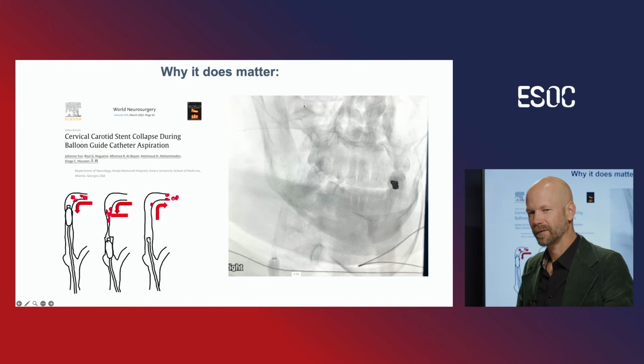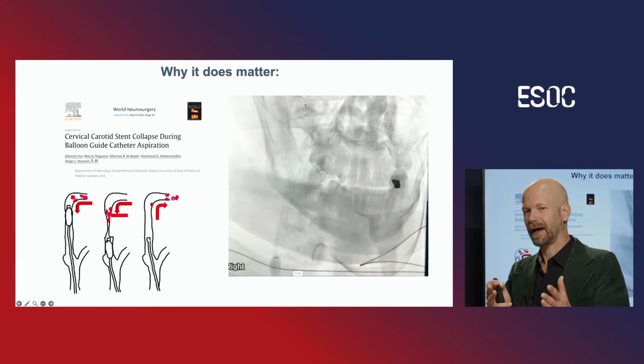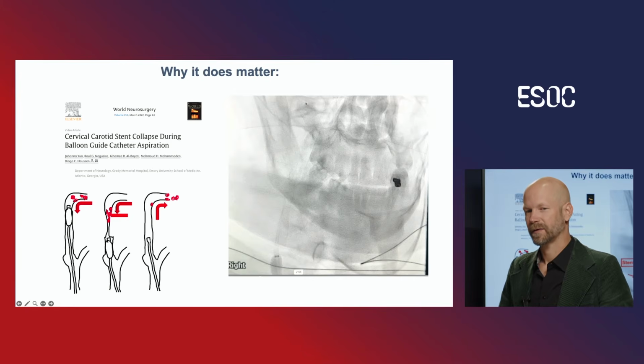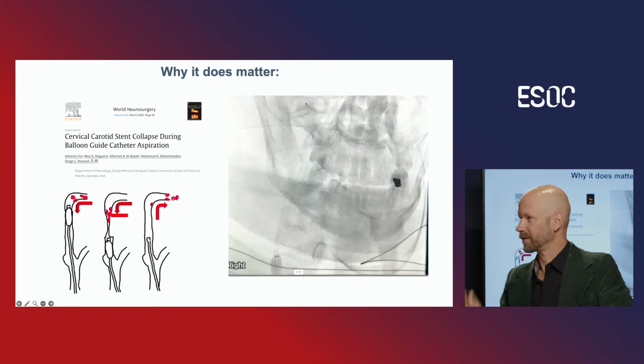If you aspirate from a proximal position, then what you can see here in the video, the ICA will just collapse, and you create a lot of force at that position, and then all the debris and fragments will just stay distal of the balloon guiding catheter, and then if you open up again, everything goes upwards. And I think this is the main reason.